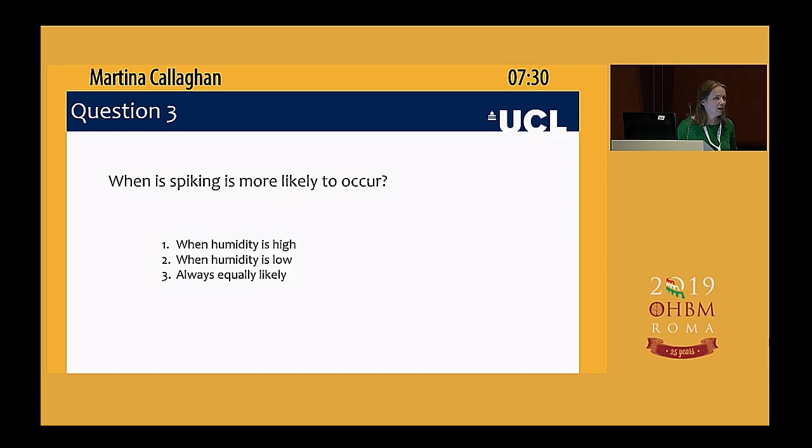How do you measure your environmental conditions? Do you do it with these scanner monitors, or do you have a telltale that's either inside the room or in your HVAC system from your air output? Yeah, so we do it independently of the scanner so that it's a really independent measure. It's coming from sensors inside the room that are either relayed onto the BMS display in the room, or we would have one just inside the window. If we didn't have the display on one of our systems, we just used one inside that we could see through the window.